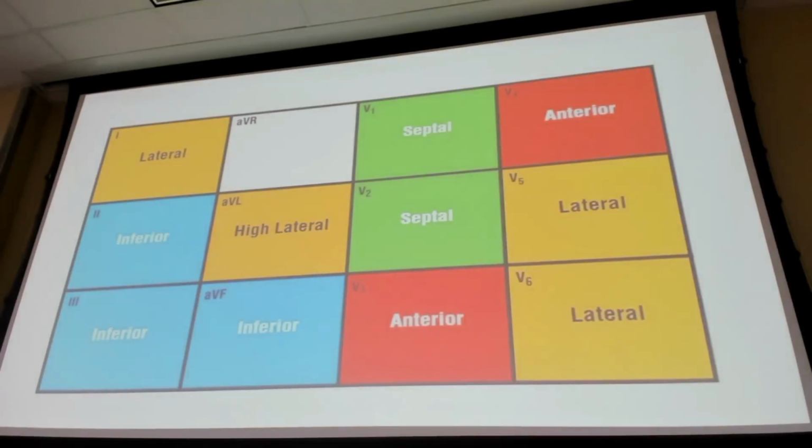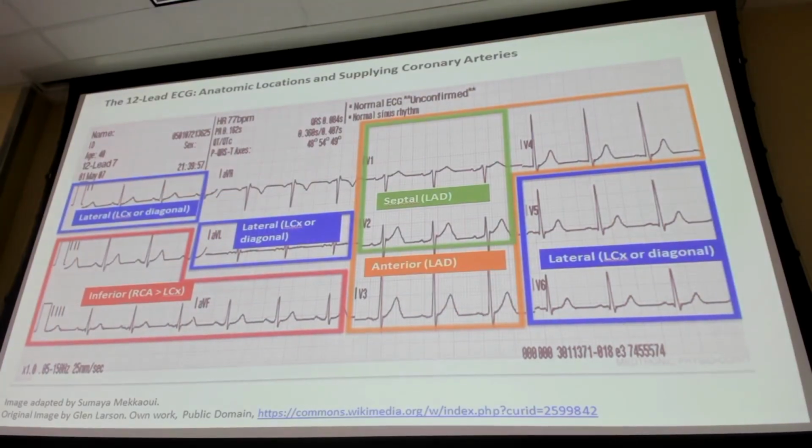All right, here's some study aids. So this is just, once again, looking at your EKG findings, where those leads should show elevation, where you should see reciprocal changes. And here's a better one. I like this one, probably the best. So this one has which arteries might be involved, most commonly with STEMI, and then which location it's in, whether it's lateral, septal, anterior. So these are good little study aids. Hopefully you guys already memorized this by now. You don't even need it.